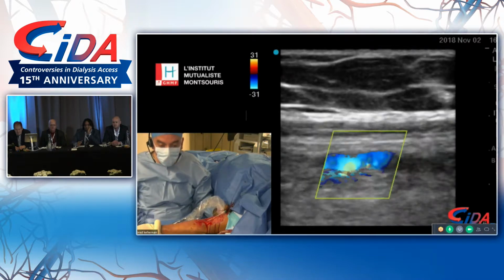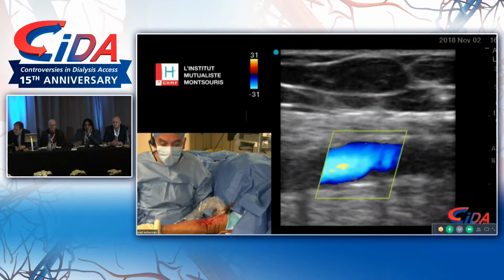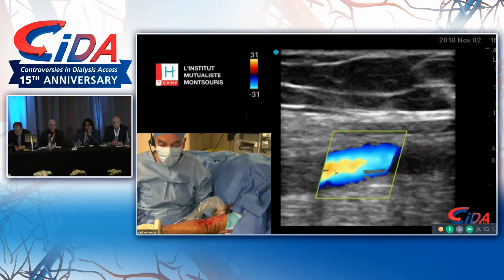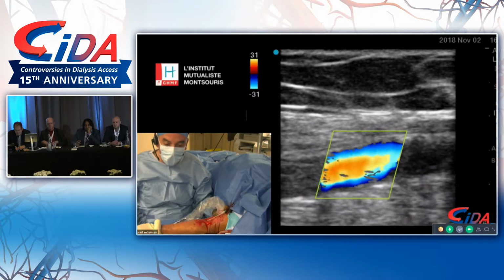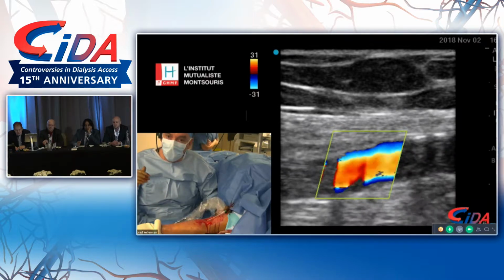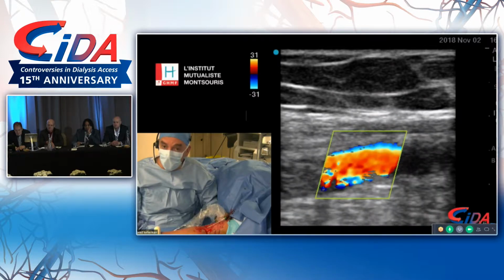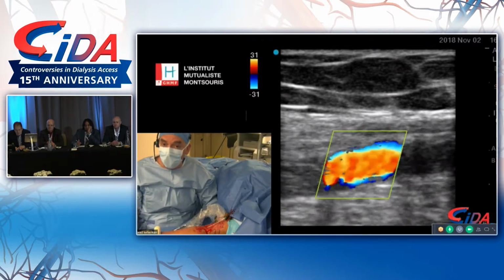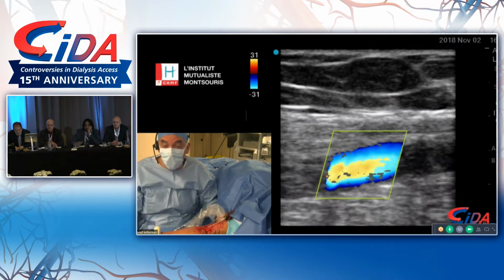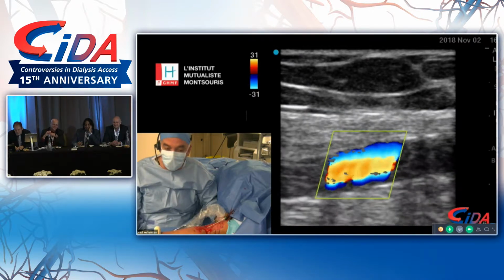So I had to do 10 patients with the guys from Avenue that came here in Paris to help me. Of course, the first punctures can be challenging because you're starting a case and you say, well, what the heck, it's just a puncture, I should be able to do it. But it's kind of challenging because you have to go from the vein into the artery. After 10 cases, I felt pretty comfortable to do it on my own. And this is what I see with my partners. After 10 cases, I help them, and they are independent. I know we're pretty awesome guys, but I don't think we're Superman. I think anyone can do it after some teaching.